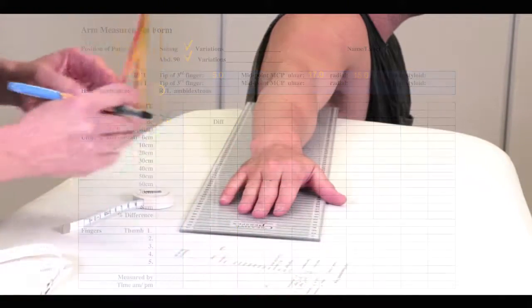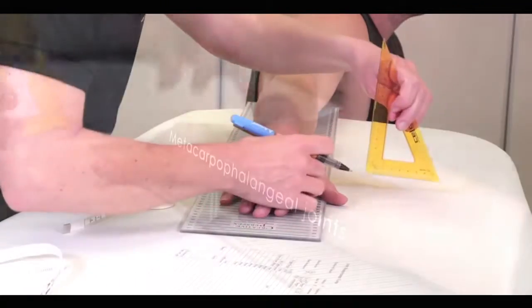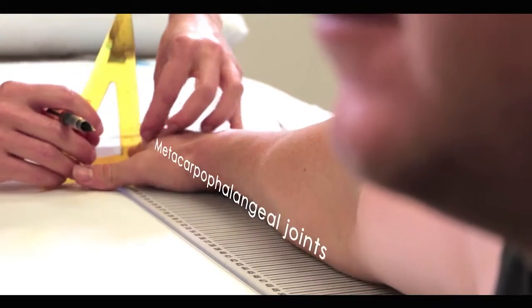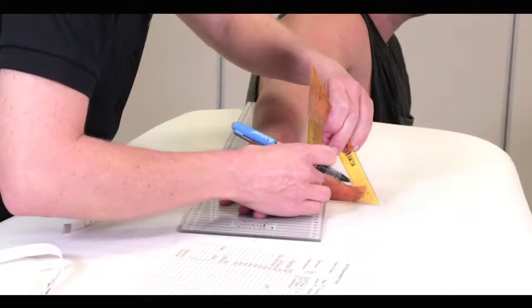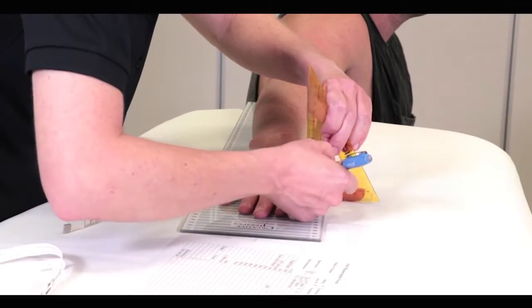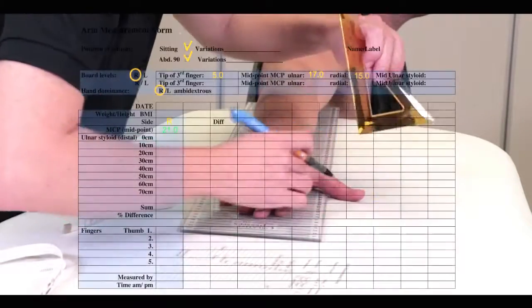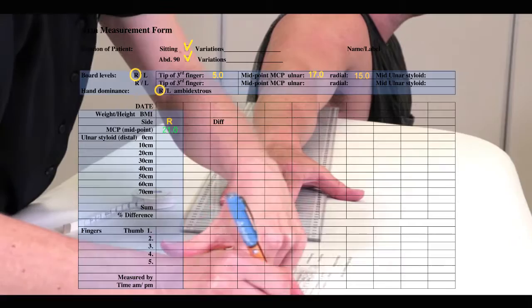To find the metacarpophalangeal joints, feel for the joint line with the hand flat on the board. Mark the hand on the radial or thumb side and on the ulnar side at the metacarpophalangeal joints. Record these positions on the board on the arm measurement form.